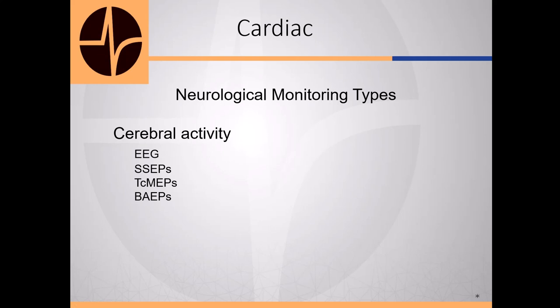But the subcortical SSEP responses, as well as auditory evoked potentials, are much less affected by core temperature, and they're also less affected by anesthetic regime. So, and they're known to be present even in the absence of suppression of cortical activity.